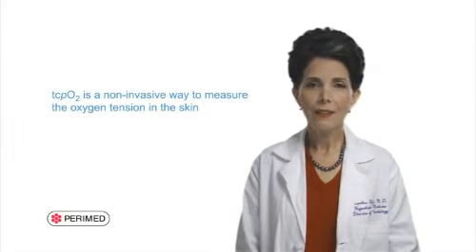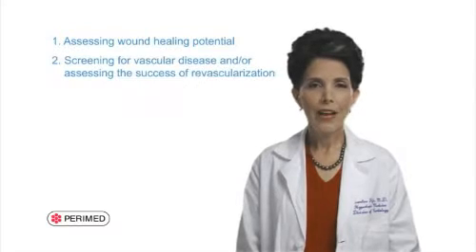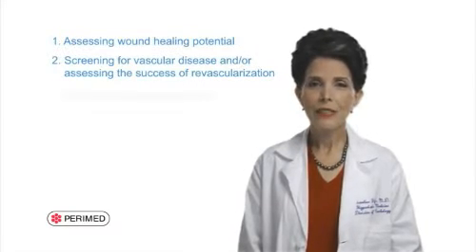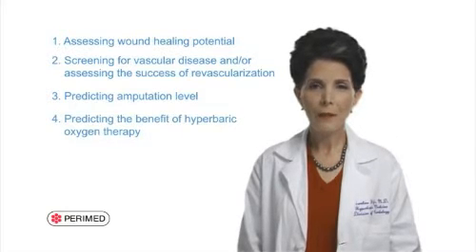I've been using transcutaneous oximetry, often known as TCOM, or more accurately, TCPO2, for the past 20 years. Transcutaneous oximetry is a non-invasive way to measure the oxygen tension, that is, the partial pressure of oxygen in the skin. The 4 applications of TCPO2 we will discuss in this video are assessing the wound healing potential, screening for vascular disease and/or assessing the success of revascularization, predicting amputation level, and predicting the benefit of hyperbaric oxygen therapy.